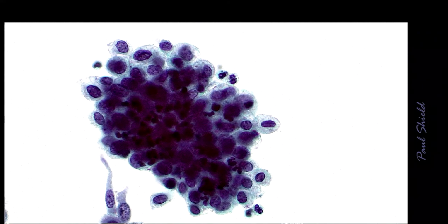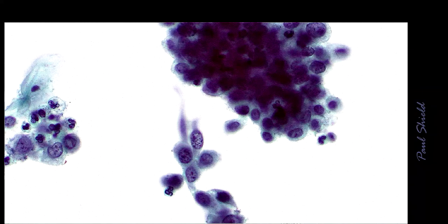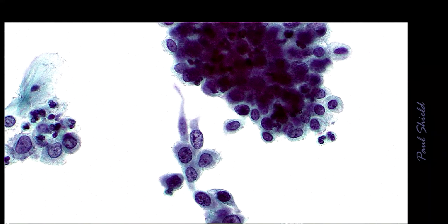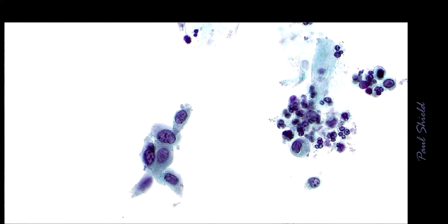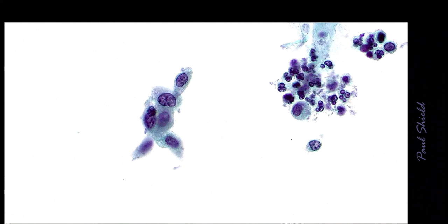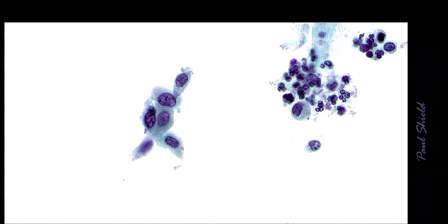Very high NC ratios, and this one's showing a couple of spindly type cells in the middle there, and that's typical of squamous differentiation. And if I see that, I'm thinking high-grade squamous intraepithelial lesion. Again, just a couple of cells showing that irregular nuclear membrane, so little indents and notches in it.